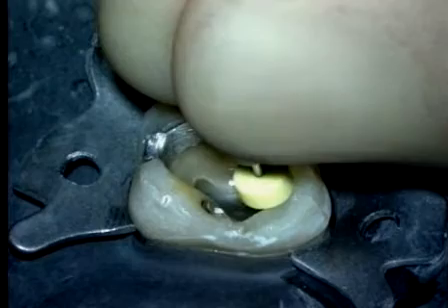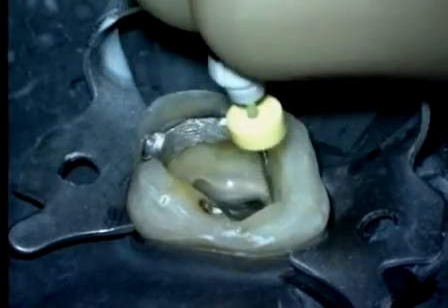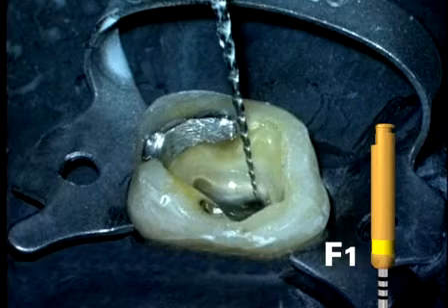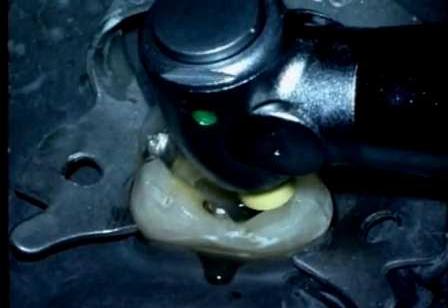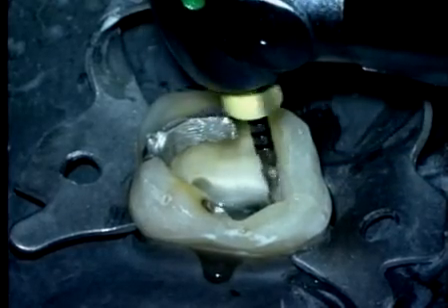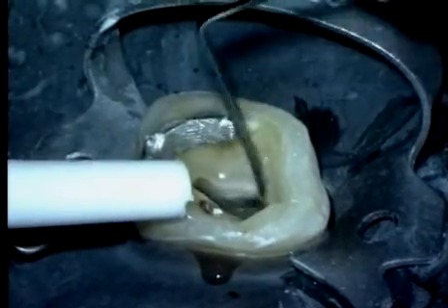Now we reconfirm the glide path, and this is accomplished by taking progressively longer strokes. When we have a smooth and reproducible glide path, we're ready to proceed to finisher number 1, which has the yellow identification ring on its handle. This instrument is allowed to move easily into the canal and floated to length. Generally, it will achieve length on the first pass. When we've achieved length, the instrument is immediately withdrawn. Now we can irrigate, recapitulate, and re-irrigate.